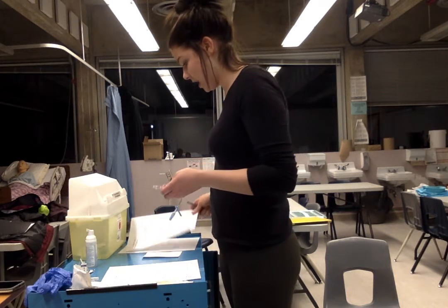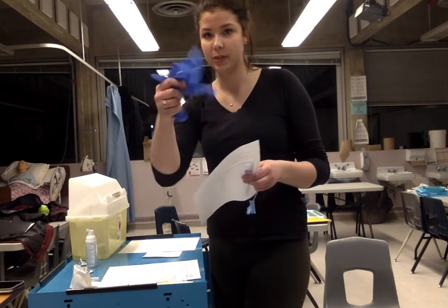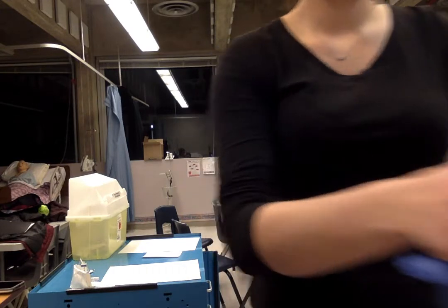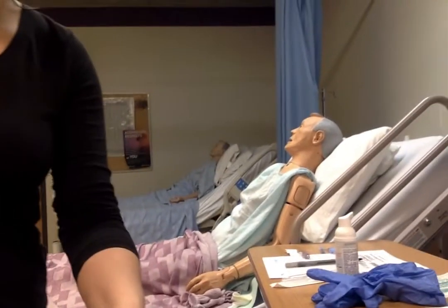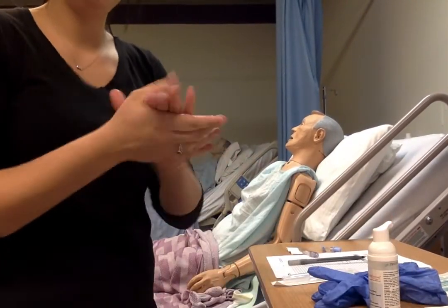I'm going to take my MAR, and then I'm going to take some gloves to protect myself, and some hand sanitizer, and my needle. All right, so we'll just give my hands a wash again.